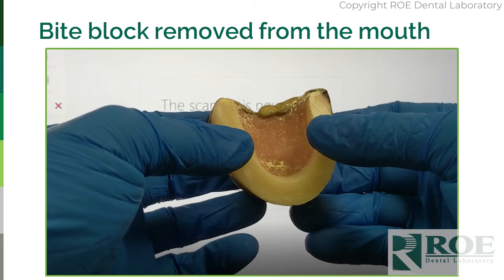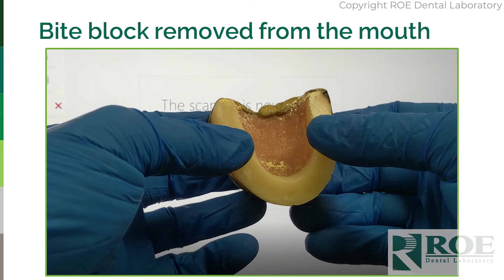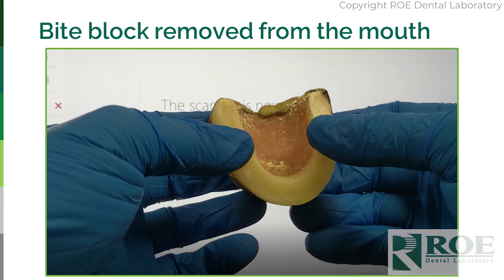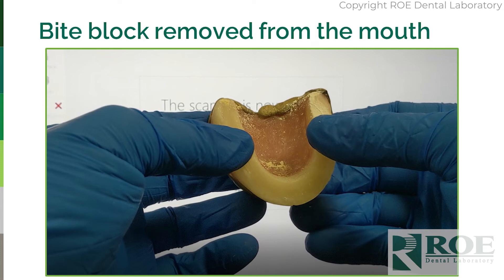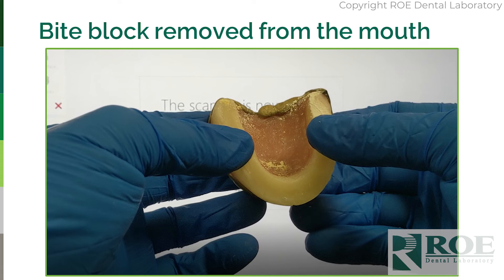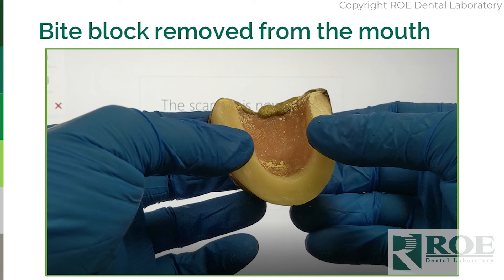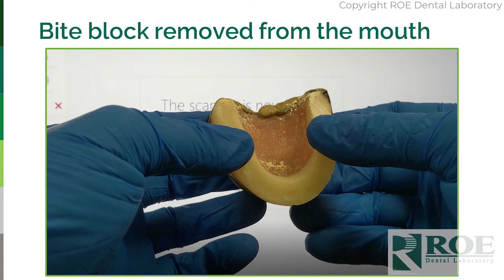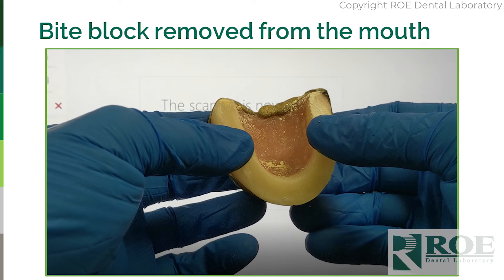During this process, once the bite block stage is completed in the mouth, the bite block is taken to the iOS scanner and you scan the bite block. If it's a single arch, you scan the bite block, seat it back in the mouth, and scan the opposing in bite. This presentation is going to show scanning a double arch, and there are some key steps into scanning a bite block.